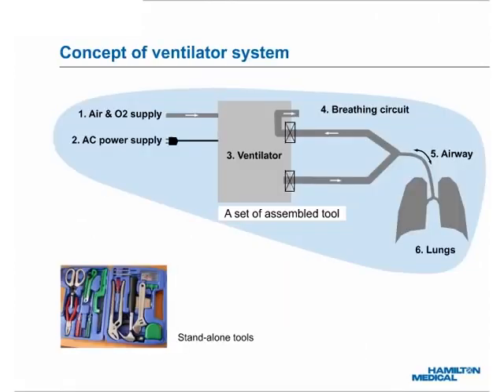A tool is defined as a device that is used to produce or achieve something, but is not consumed in the process. Typical tools that we know well are a wrench, a hammer, a knife, a pair of scissors, or even a bicycle. Is a ventilator a tool for mechanical ventilation therapy? No. The therapeutic tool for mechanical ventilation is a ventilator system, which usually has 6 parts.